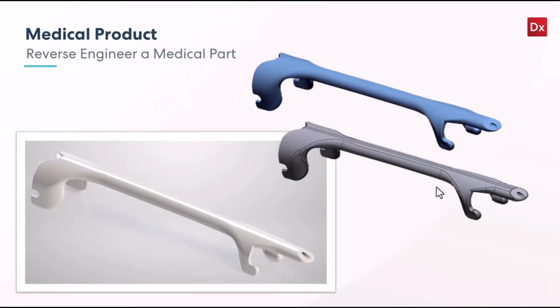For today's webinar, we are going to cover a medical part. So with that, we'll go ahead and just jump right in today. So here is this medical part, and this is a probe that goes on a sonogram machine to be able to take biopsies. It's a specialty part, and there are a million variations of these parts for different types of probes and stuff.